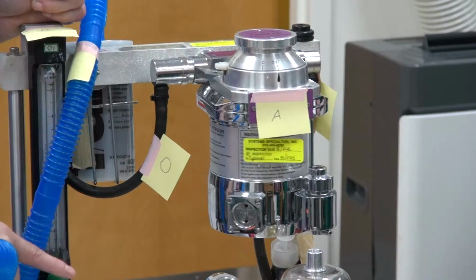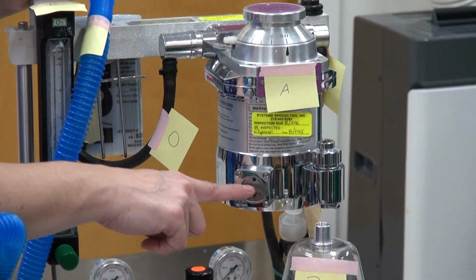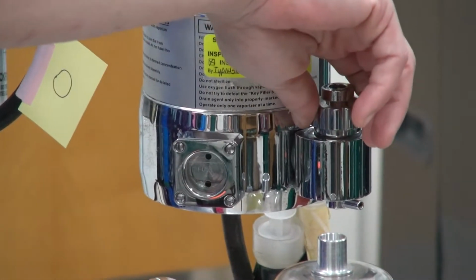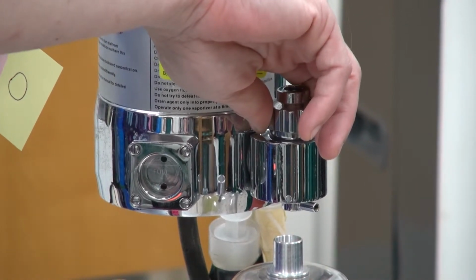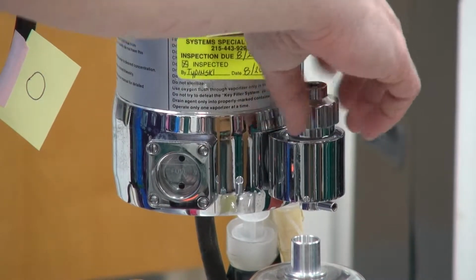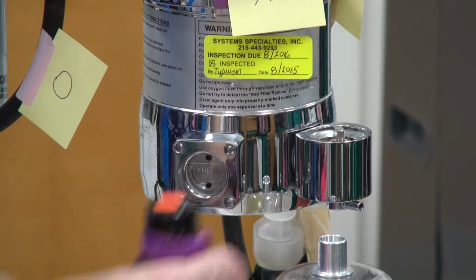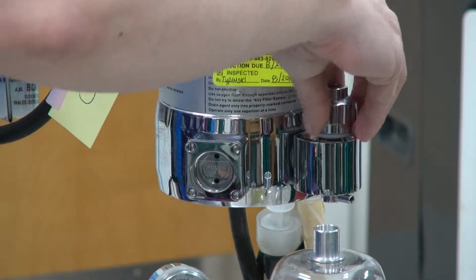Yellow. Correct. Okay. When I am filling my vaporizer, is there a fill line in here? Yes. I want to be at the fill line, correct? Yes. When I am filling my chamber with the liquid anesthesia, which way am I turning to open? Left. Turning left, I'm opening my chamber, I'm adding my liquid, correct? And then I'm turning right to tighten.